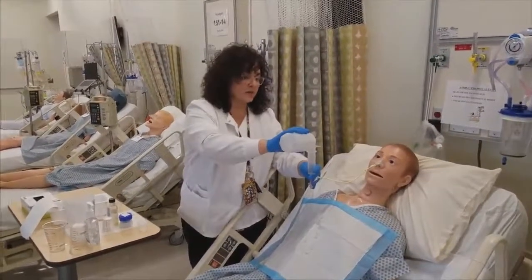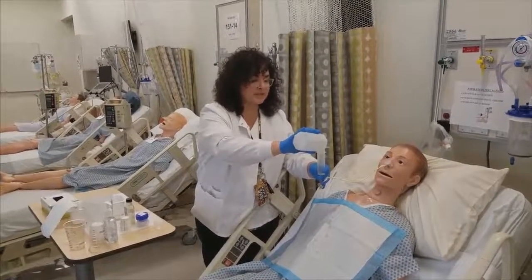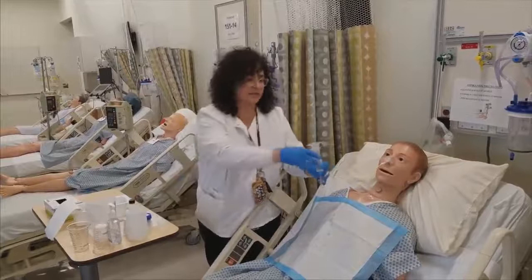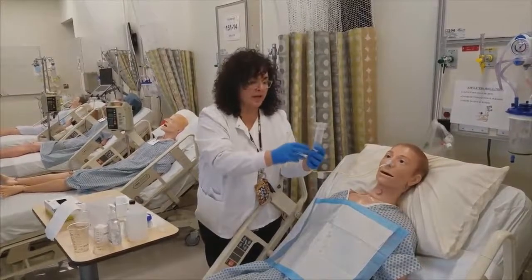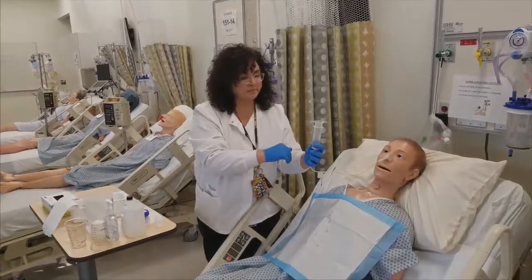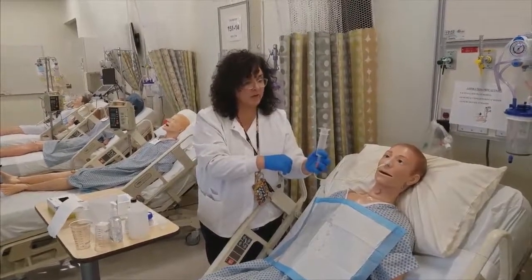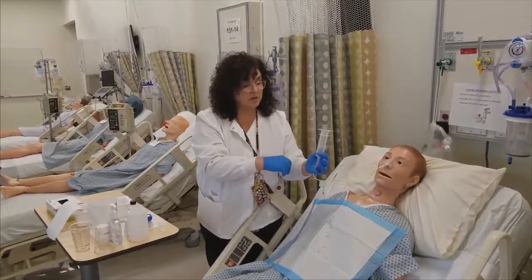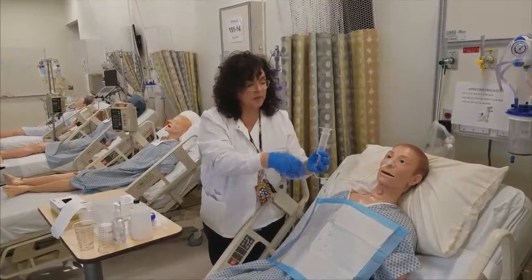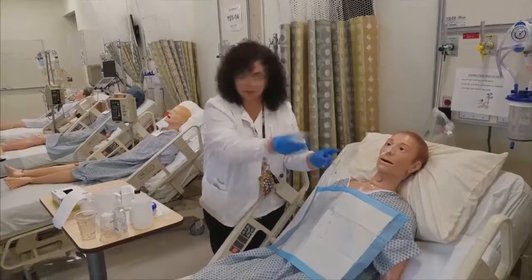Based on what I just gave the patient, it would make sense for me to give closer to 60 to make sure that the medicine was rinsed down well, and so we don't run into problems with the tube occluding. So I'll let that go down. Okay, that's my post flush.